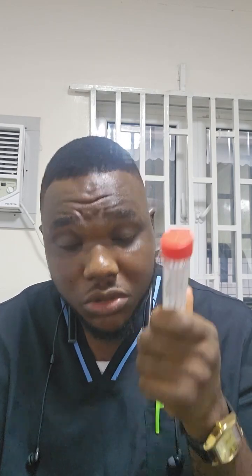Now, apart from medical microbiology, we can also use this in the chemical pathology lab. For example, if I want to do 24 hours urine protein estimation, it should come in this. If I want to do albumin creatinine ratio, the urine should come in this. If I'm to do fecal occult blood, the stool should come in this. So we also use it in the chemical pathology laboratory.